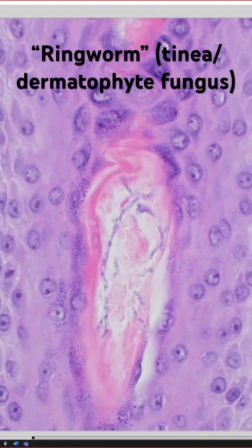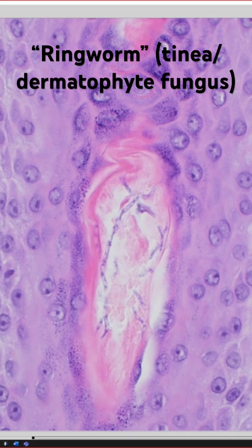And look here — this is another feature to remember too, that when you're thinking about dermatophytes, check in the hair follicles, because sometimes you have dermatophytes extending down the hair follicles.